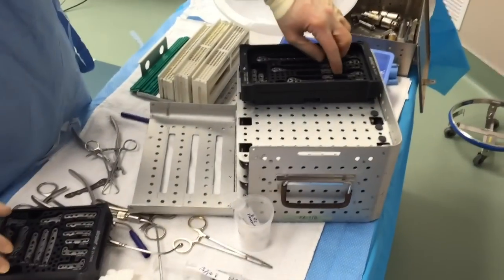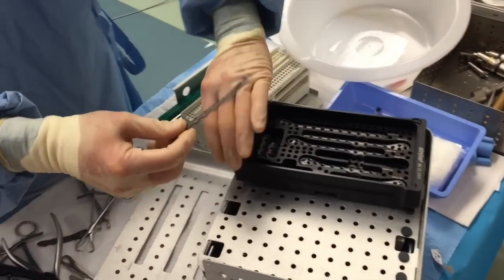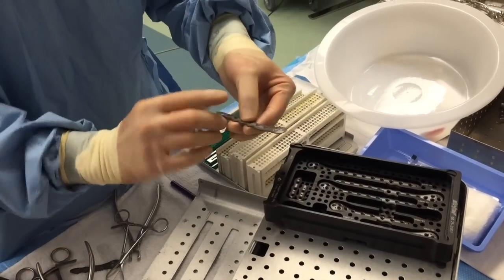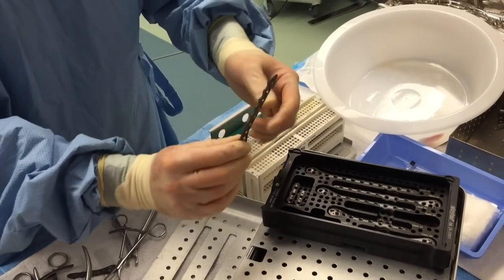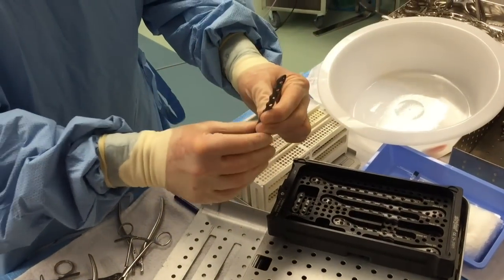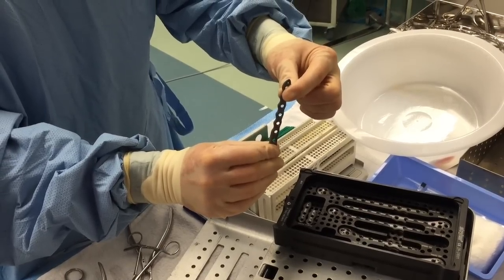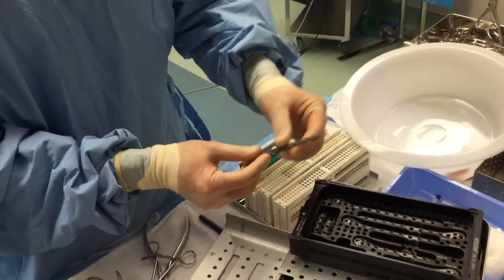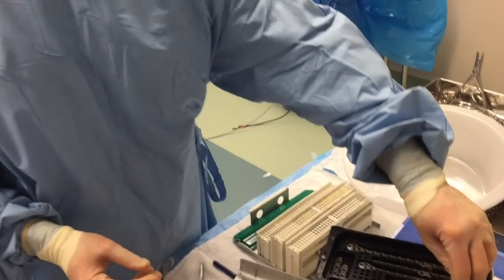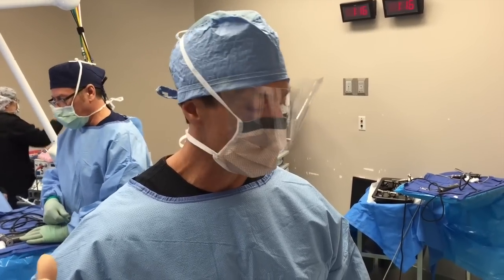They're for the fibula and they have a nice teardrop area that fits on the outside of the ankle bone to cut the outside of the fibula, and also on the larger part to get multiple screws, and different lengths of plates to go up the proximal aspect of the fibula. Today we've chosen the smallest plate — I'll show you on x-ray what we use next and we'll move over to the fracture site in one second.